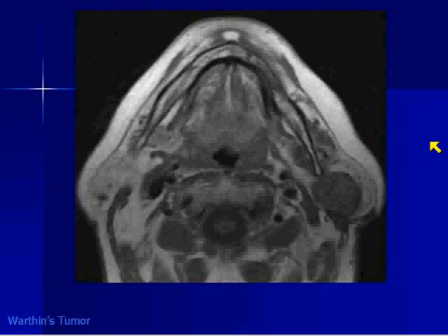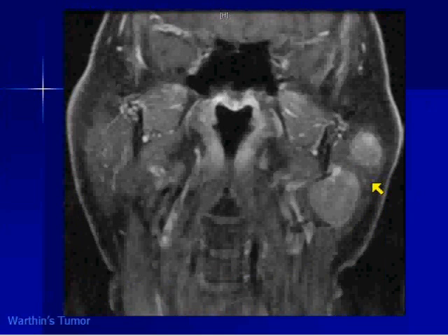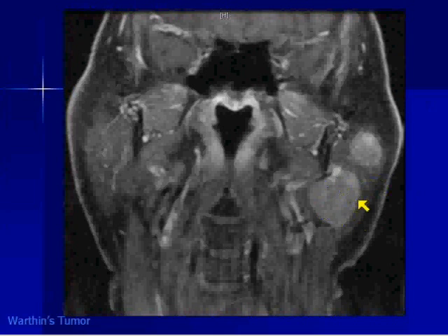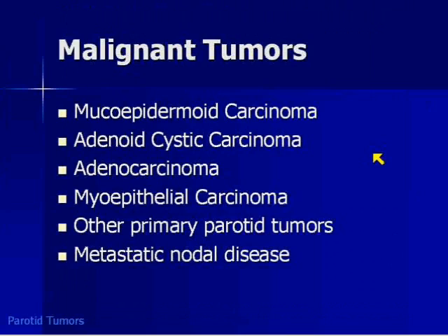Here's an example of a well-defined lesion — this one happens to be solid — in the tail of the parotid gland. This is a Warthen's tumor. There's no cystic element in this one, but it could be cystic, solid, or combined. This is the same patient — it's nicely enhancing, and you see a second lesion. He's a smoker, an older guy — this is more consistent with Warthen's tumor.